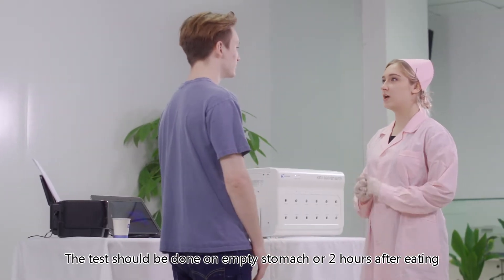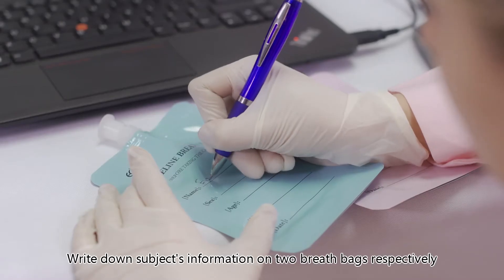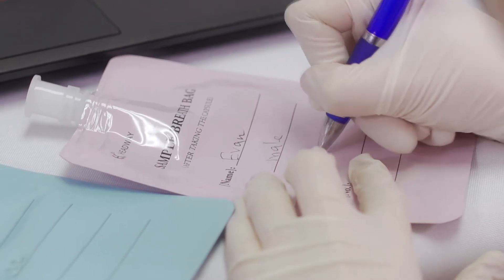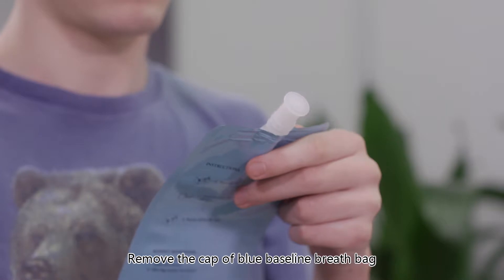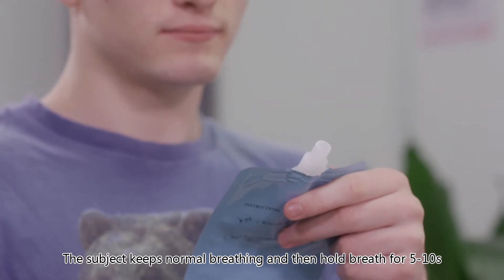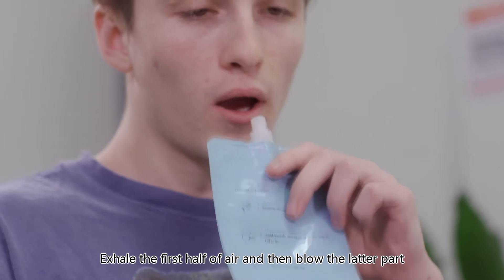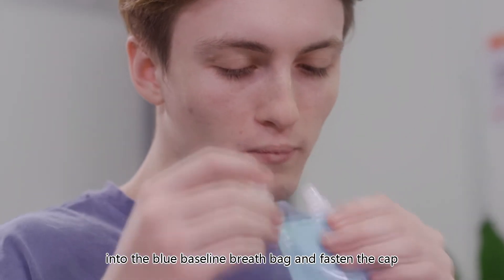The test should be done on an empty stomach or two hours after eating. Write down the subject's information on two breath bags respectively. Remove the cap of the blue baseline breath bag. The subject keeps normal breathing, then holds breath for five to ten seconds, exhales the first half of air, and blows the latter part into the blue baseline breath bag, then fastens the cap.